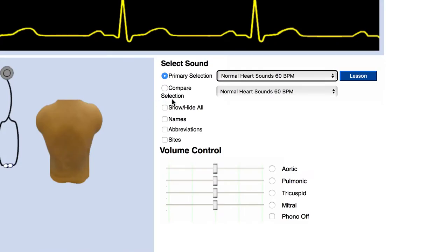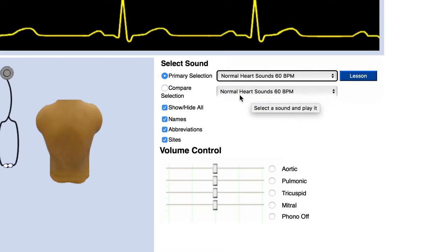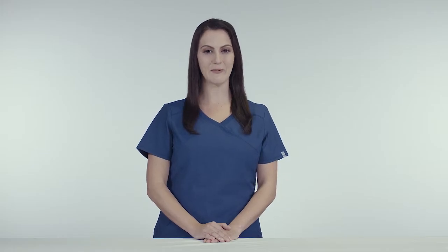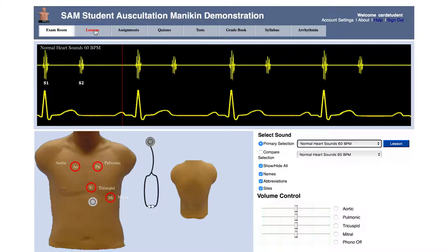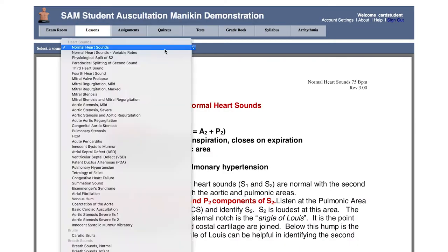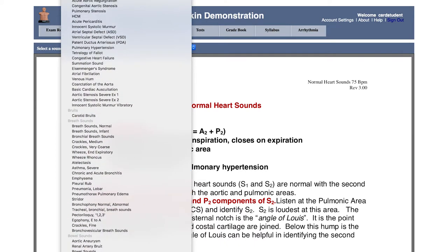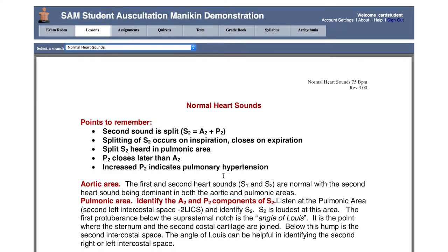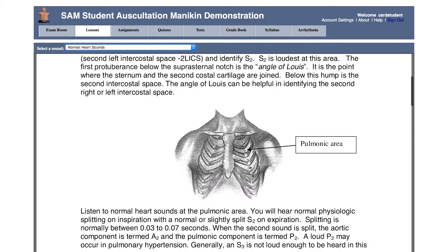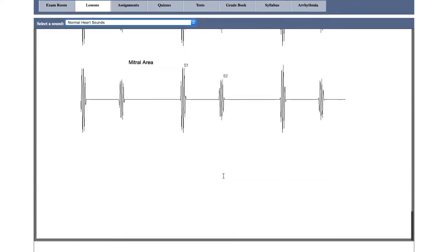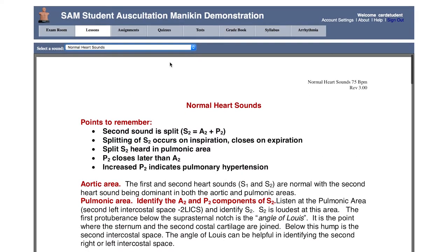To find the lesson guides, there are two ways to do so. While listening to the sound in the exam room, you can click the lesson button next to the selection bar. Alternatively, you can search our entire library of over 60 lessons within the lessons tab at the top. Choose from any of our heart, lung, and bowel sounds. These lessons provide comprehensive instruction, which accelerates the learning of assessment and diagnosis for students.